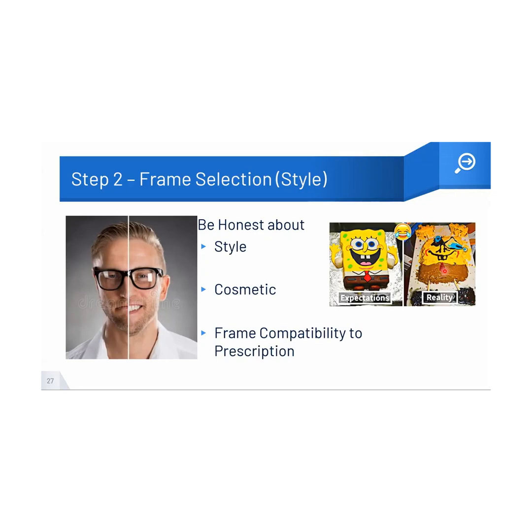it is always important for you to be with them, provided you feel that the customer has a narrow face. With modern designs in place, it is going to be really challenging for you in case they end up selecting a frame and then you say, okay, we'll not be able to do it. So it is always better to be along with them during the journey.